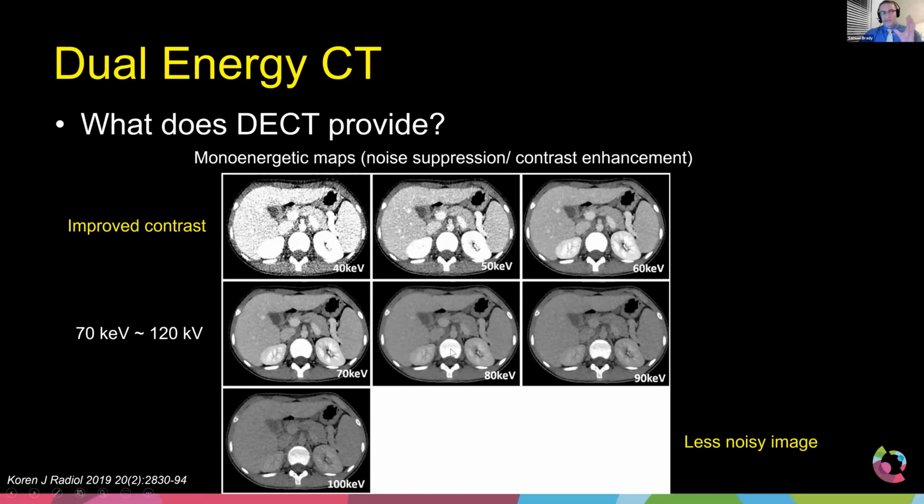sometimes kids can be difficult. And so let's say we injected the IV, but we missed. Let's say we missed the portal venous phase. As a radiologist, you're looking over at the hepatic arteries and you can't see the hepatic arteries. That's a problem, right?